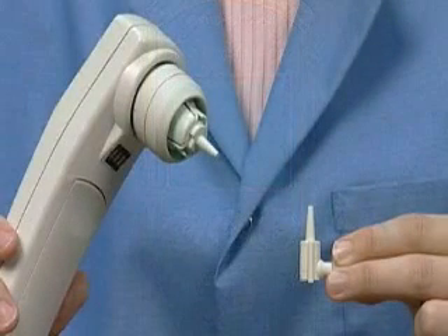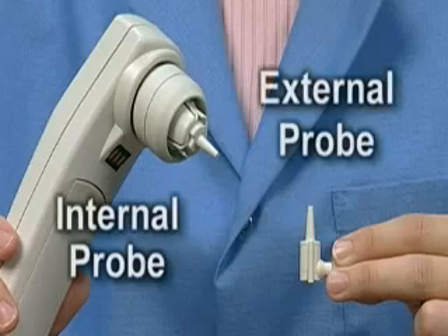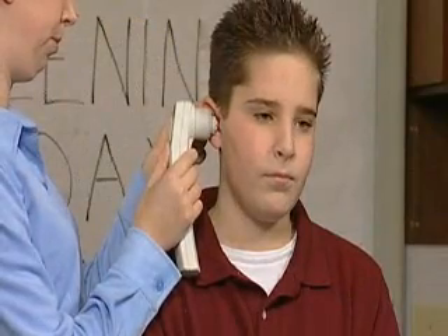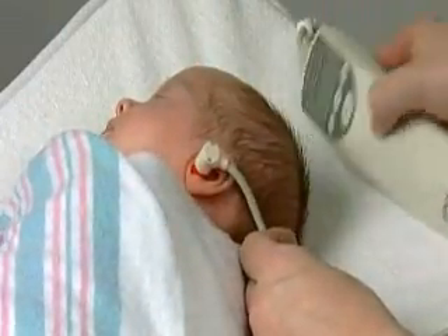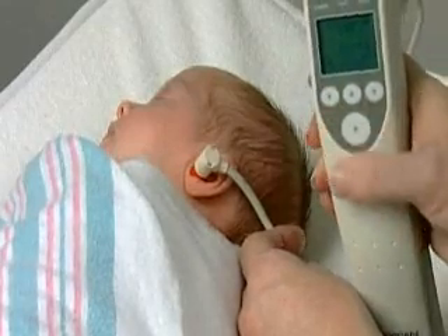The AeroScan system can be used on all test populations with either the internal or external probe. As a guideline, the internal probe is generally used for children and adults, while the external probe is used for newborns and special needs populations. These are only guidelines and you should feel free to use what works best for you.